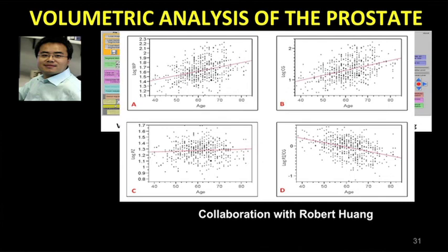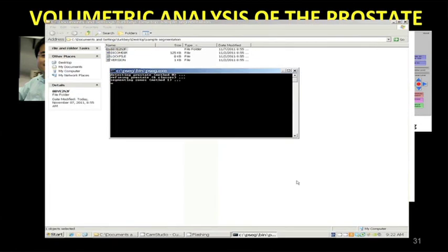Automated segmentation, automated volume detection, and automated segmentation for using these meshes for our biopsies, for our molds, and for several other research purposes. So we worked with a company called ICAD. We gave them these 500 patients, we trained them, and they came up with a very interesting automated prostate segmentation tool. There is no human interface. It gives you the segmentation of the 2 zones in 5 to 10 seconds, depending on the power of your computer. And here is a real video of that.